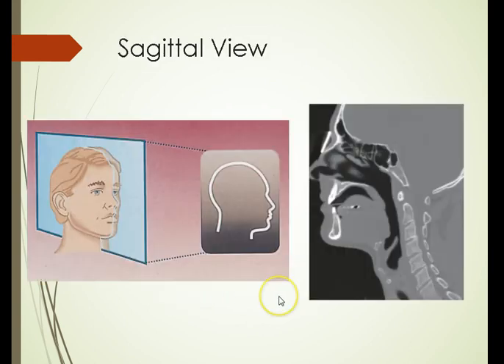That's important. So when we talk about CT, the goal is to educate you how to read a CT, how to manipulate it, and use it to your advantage when you're looking at it for implants. Okay, so the basic thing you have to first understand is views. What angles do most CTs come in?